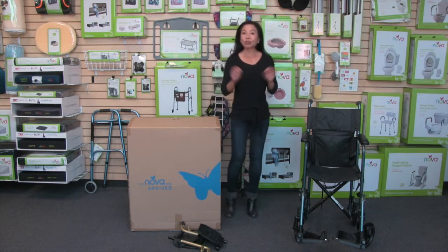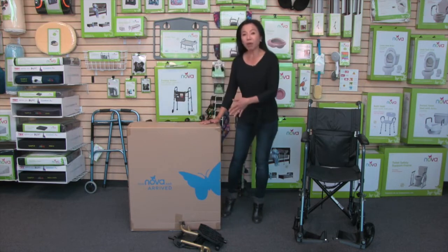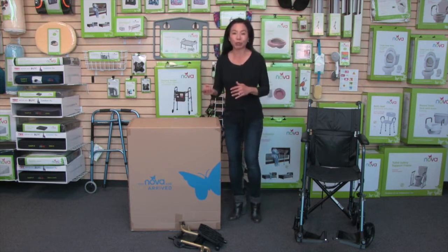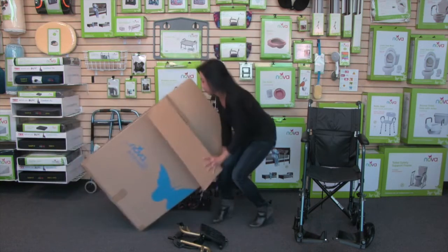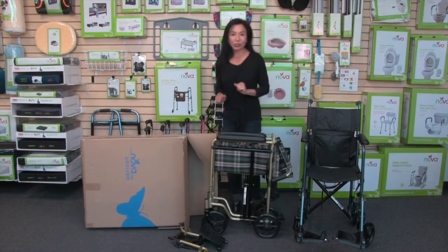The first thing I'm going to do is show you how to get it out of the box. When you receive your transport chair, it will show up in a box just like this, and you're going to remove a smaller box inside — that contains the footrests. It's easiest to turn the box on its side and then roll the transport chair out rather than lifting it out of the box.